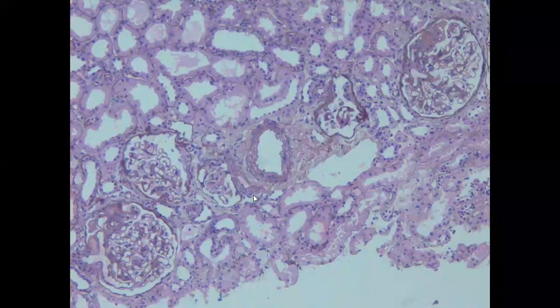Again, a silver stain which shows that some cases of membranous can show segmental sclerosis. So presence of segmental sclerosis doesn't mean that we are dealing with a podocytopathy in addition to membranous, whatever is there. So FSGS lesion, any glomerulus which will progress to global glomerulosclerosis, there will be a stage when there will be a segmental glomerulosclerosis also.